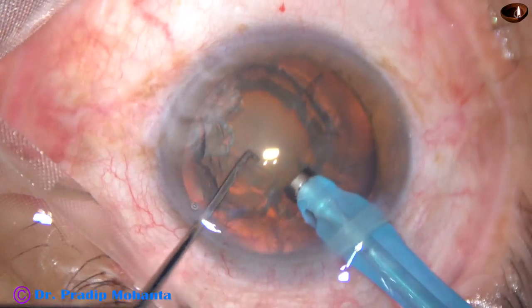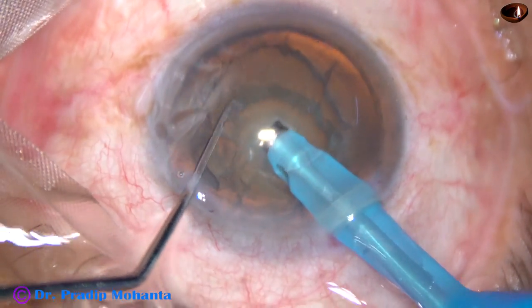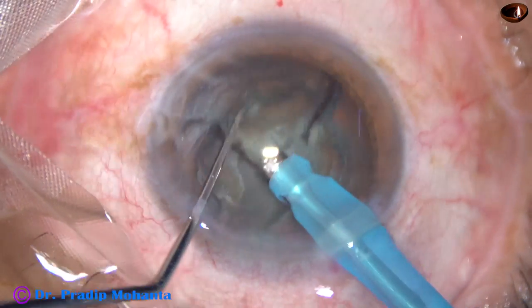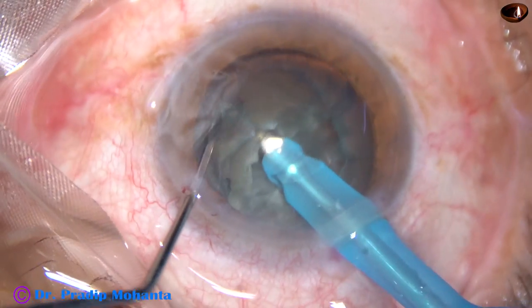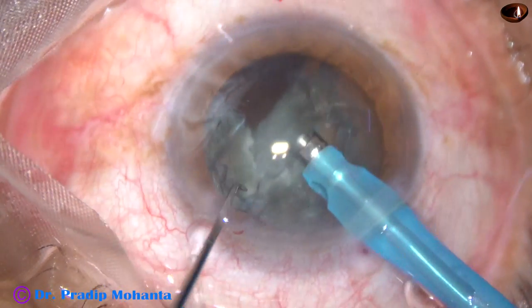Bevel is up now towards the corneal endothelium. Now the tip is buried into the substance of the nucleus. The nucleus is held very firmly and it is chopped. The nucleus is rotated and chopped at another place. And now the other hemi-nucleus is also chopped. In this way, the nucleus is divided into 4 fragments.